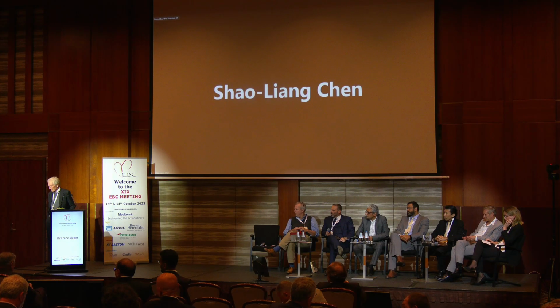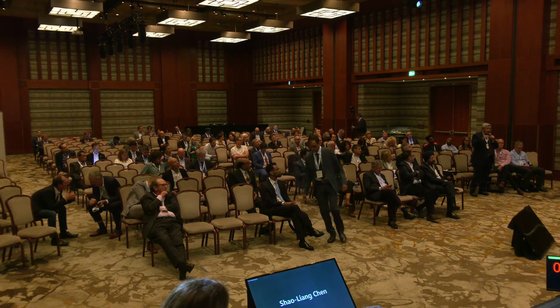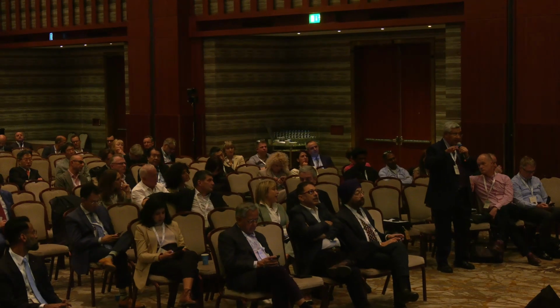Question from the audience. Do you have some specific data regarding the type of the side branch for which you use the DCB? The size, was it proximal, ostial? Because if we generalize for all side branch DCB, I think the data will be diverse. We need to know more details, which side branch you promote for the DCB.